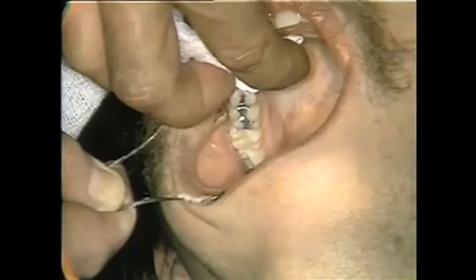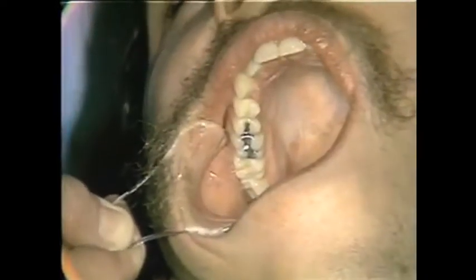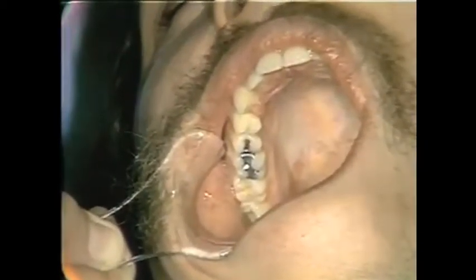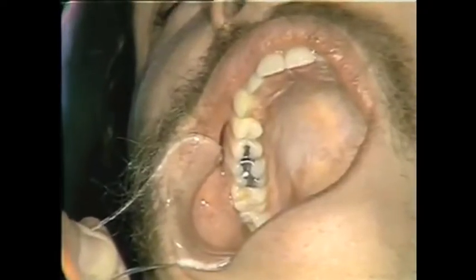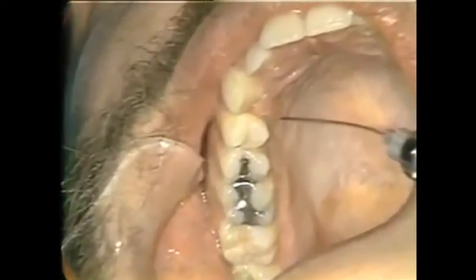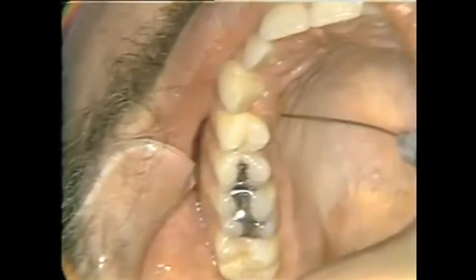We dry the mucosa, just resting it there for a moment. And then a little tincture of betadine right in the area of the injection, just palatal to the first bicuspid. And then our puncture is made about a centimeter out from the free gingival margin on the palatal surface, in approximately that position. And again, needle bevel carried to bone, and then we aspirate.